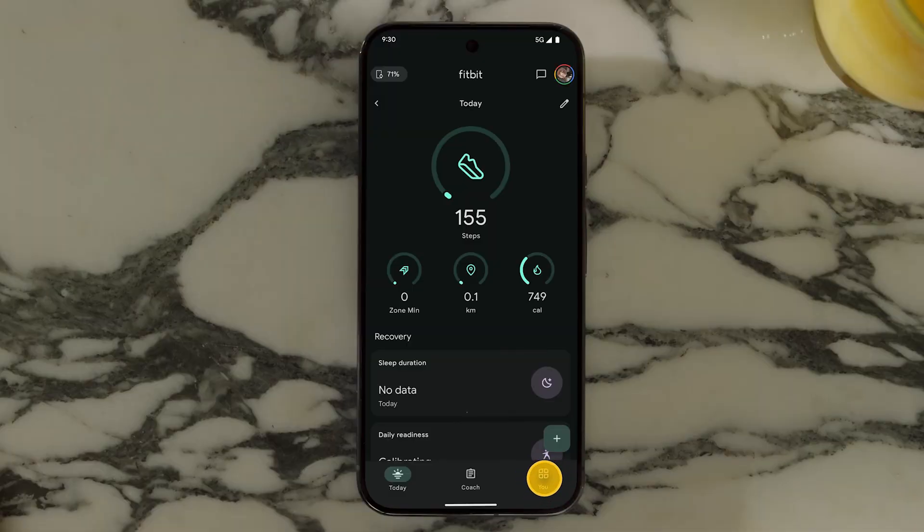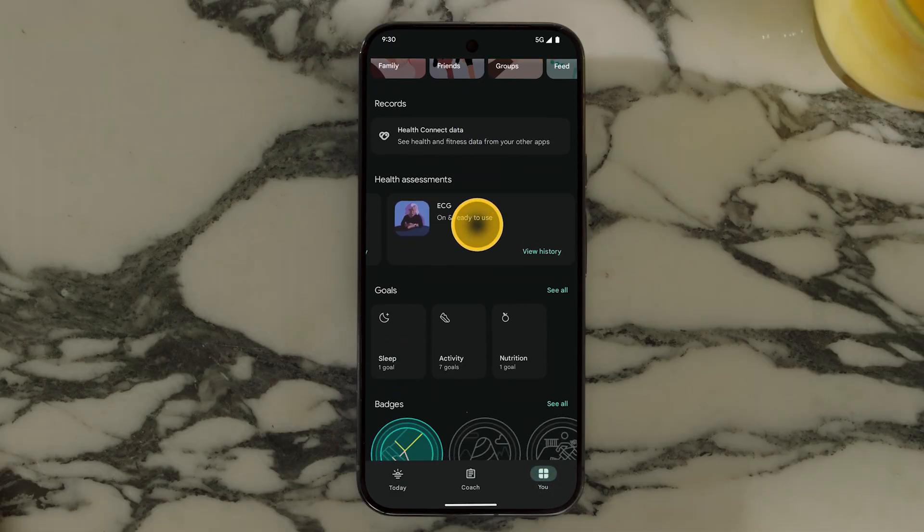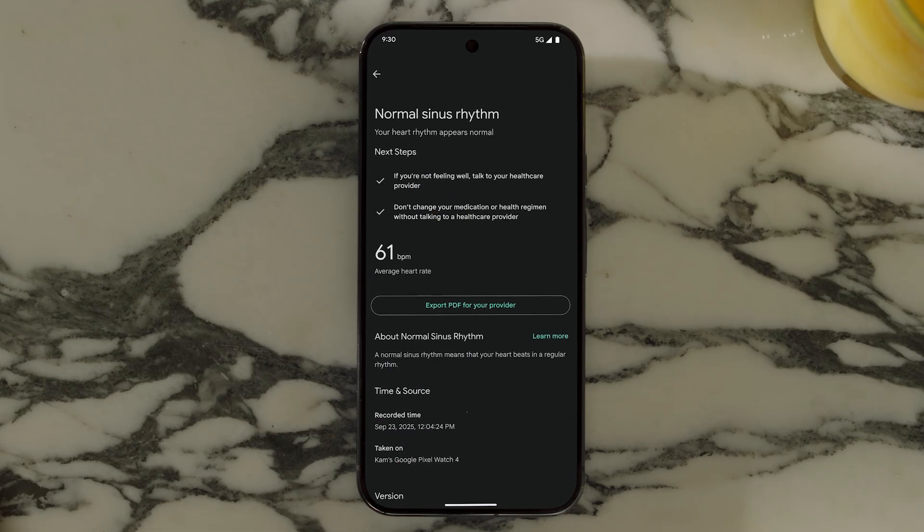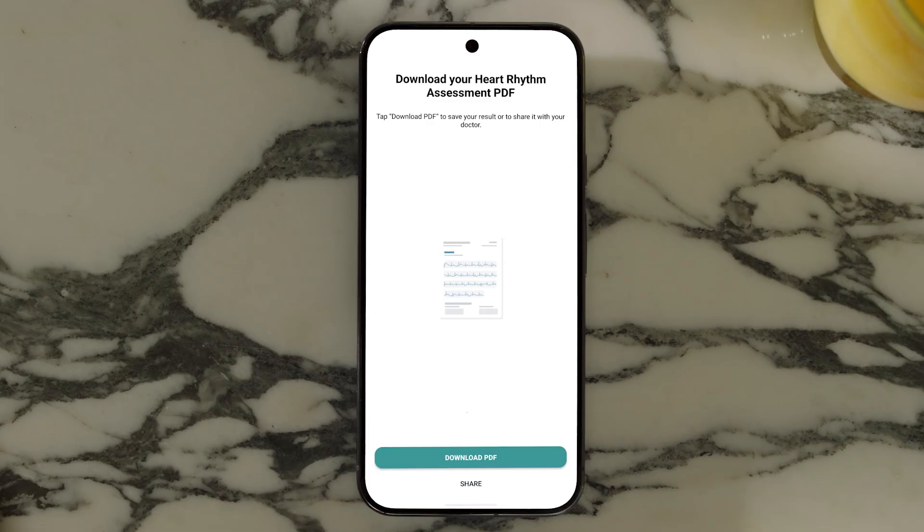You can see the results in the app anytime. To share the results with your doctor, tap 'Export a PDF for your provider' and follow the steps in the app to download and send the file. The file is saved in your inbox for 30 days.